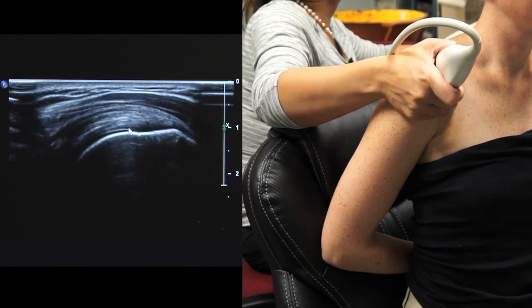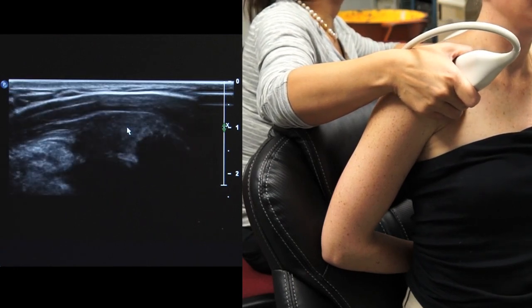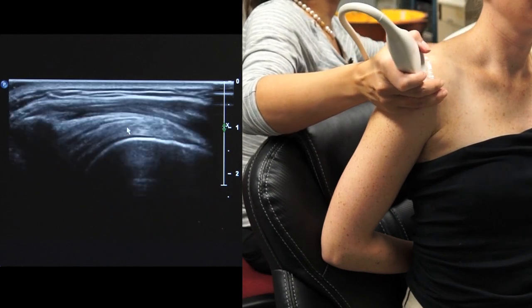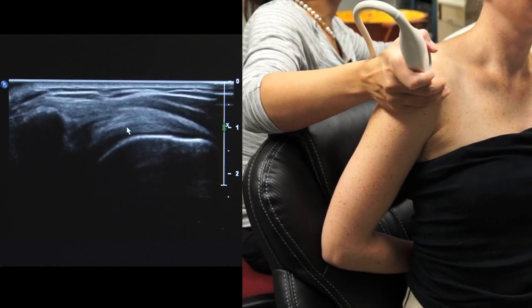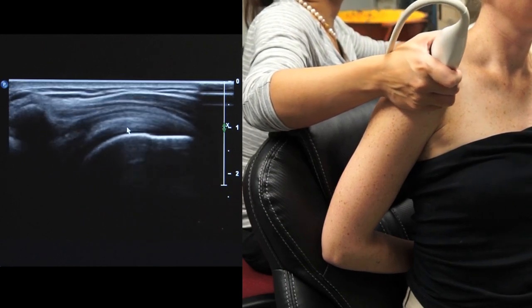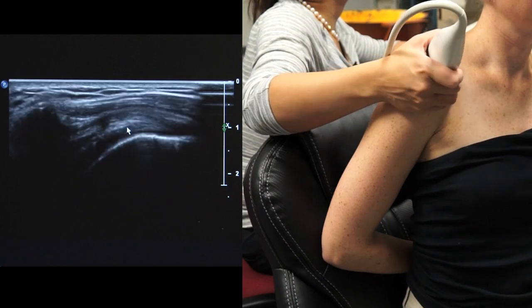And again, you will want to scan all the way anterior until you hit the biceps tendon and scan as far back as you can, noting that at this point you will be including portions of the infraspinatus as they cannot be distinguished from the supraspinatus tendon. Okay.